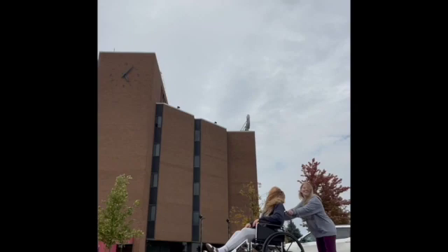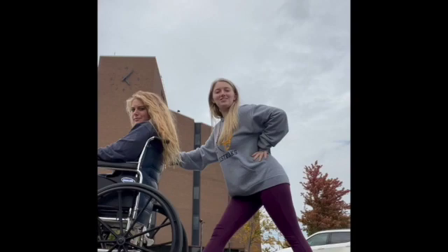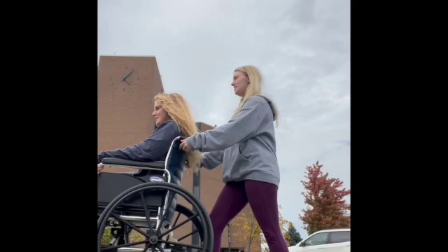To go down a curb backwards, take a wide stance like a lunge, place your knee right behind the patient for stabilization, and let them know they'll feel like they're tipping backwards — but you have a hold of them.